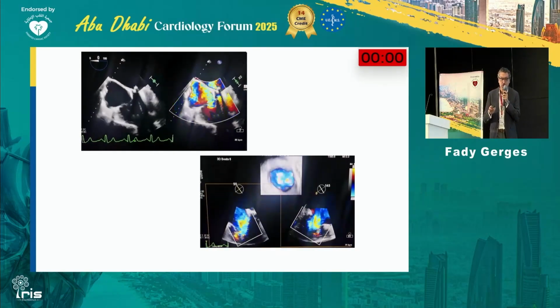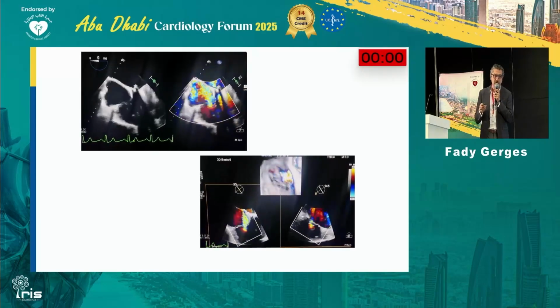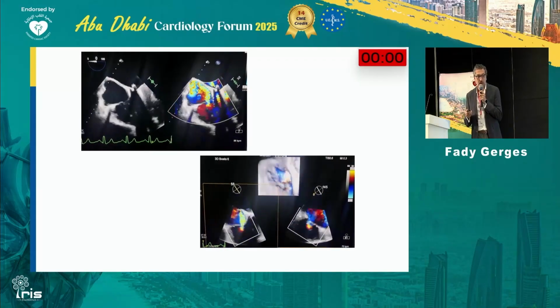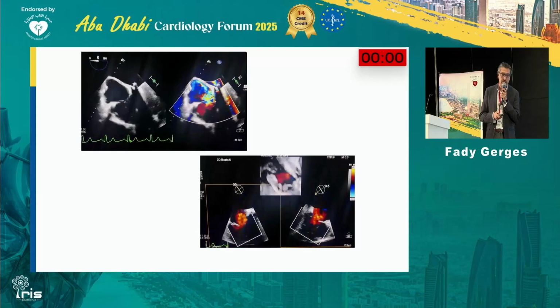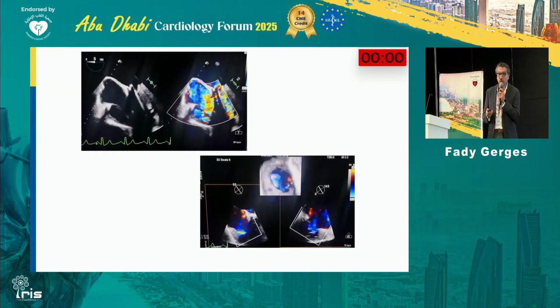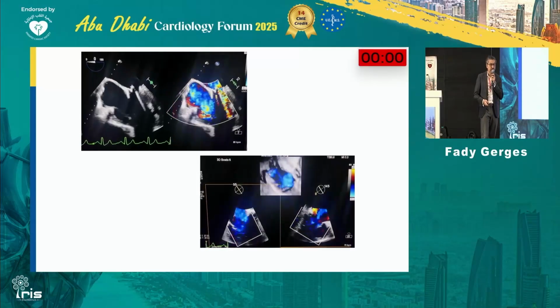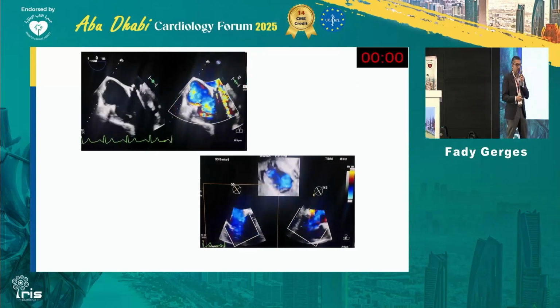And the patient is low risk. So I'm not sure what to do with this patient, whether you think this patient is good for surgery, or we can send to the structural intervention cardiologist to put 3 PDA occluders. What's the best for these patients? It's open for discussion if you want to discuss now before we move on, because we're almost finished.